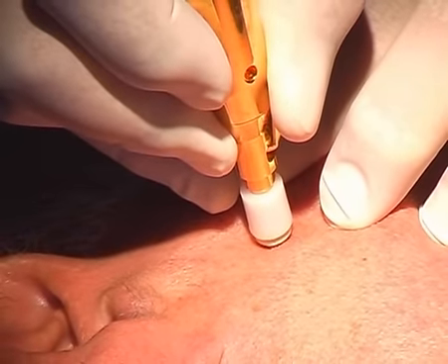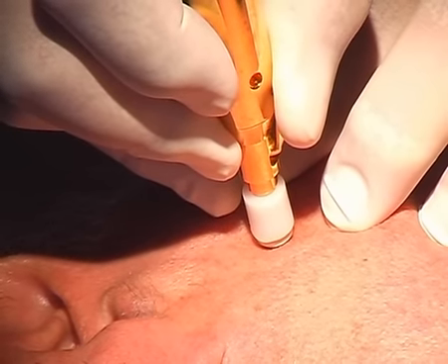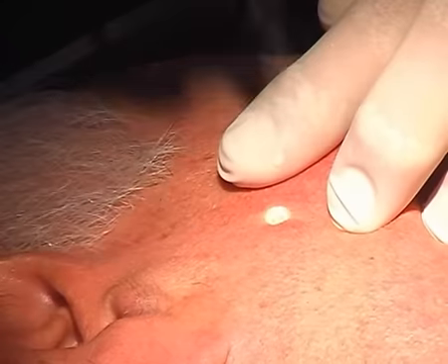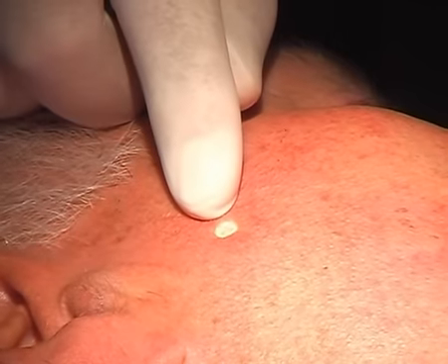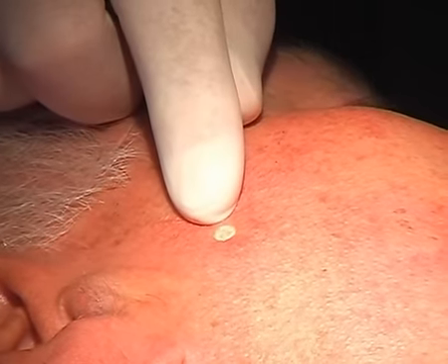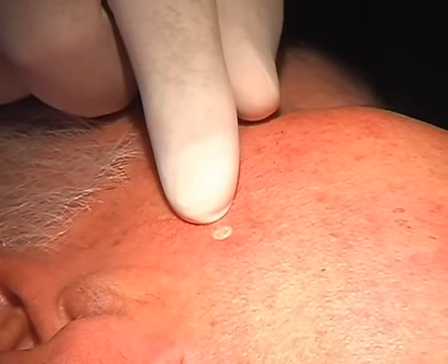After this, we are putting the tip with a light pressure onto the skin. To perform the treatment, we keep the lever pressed for 5 to 7 seconds. The reaction on the skin can be well seen. After a few seconds, the skin is thawing and a light reddening will appear.